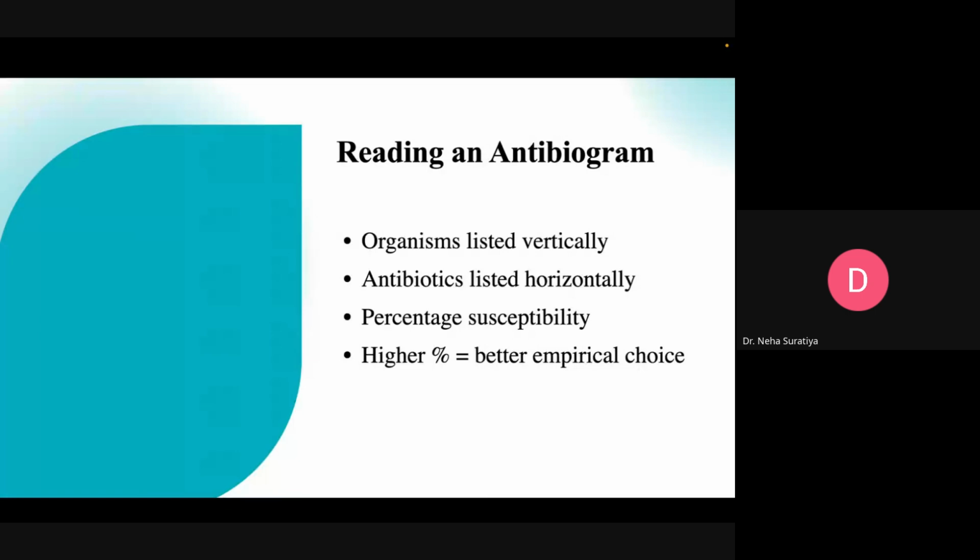Yes, okay. I'm happy with your answers. It is very important to understand how to read it because many students are not aware of antibiogram itself. They are not asking in the hospital whether there is such a thing. So understand, there is nothing like you have to give treatment only according to the algorithm of DiPiro. That is the base. But according to the resistance pattern in your geographical area, in your hospital setting, you need to correlate everything. And that is exactly where antibiogram stands. It is very useful. So yes, this is how it is read.